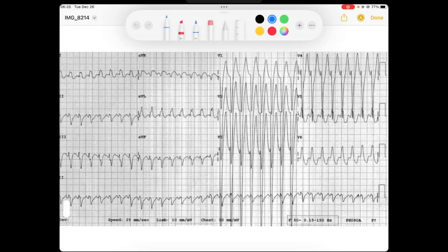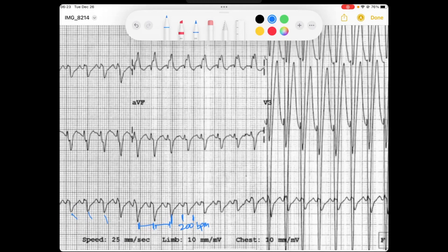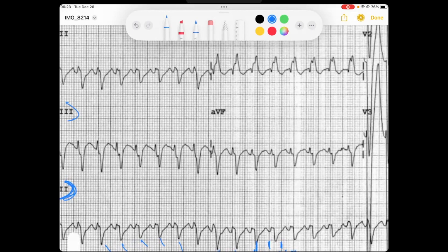First thing I'm going to do when I look at this rhythm is just look at the forest, as I say. I'll come down to this lead two rhythm strip and look at these QRS complexes — I see some funky looking QRS complexes occurring quite rapidly. It appears to be a regular rhythm, and the rate would be around 300, 150 — so somewhere maybe 200 beats per minute. If you look at lead 3, we've got a wide QRS.